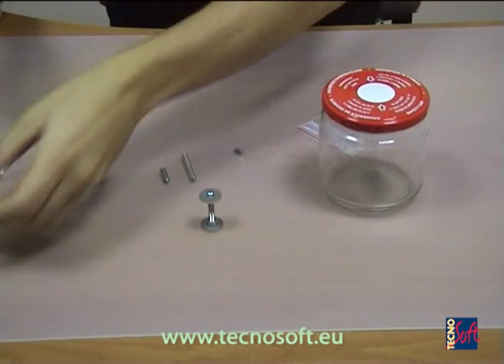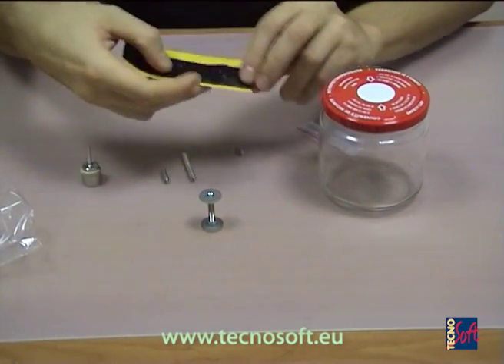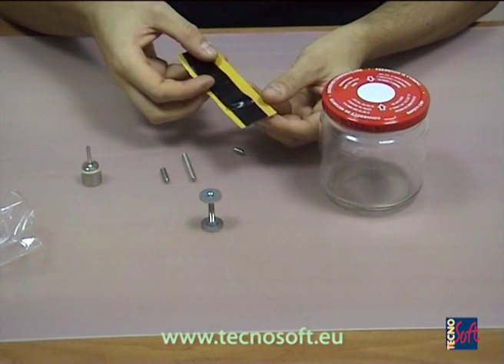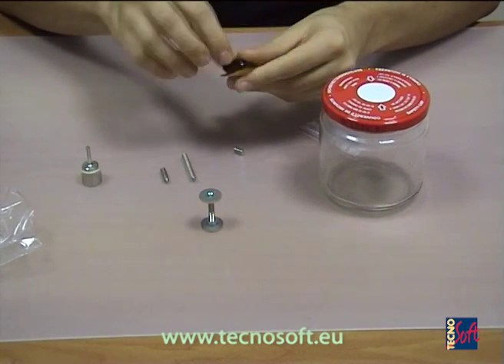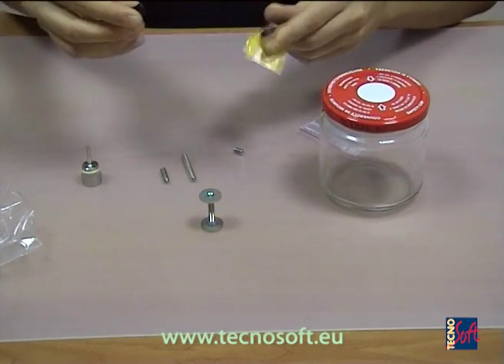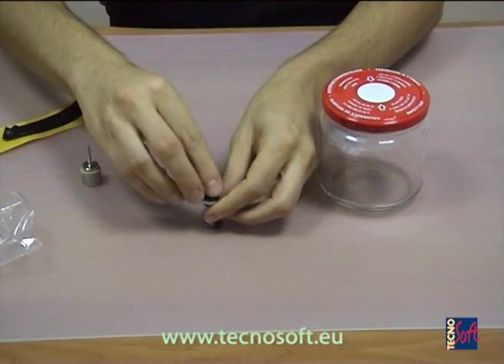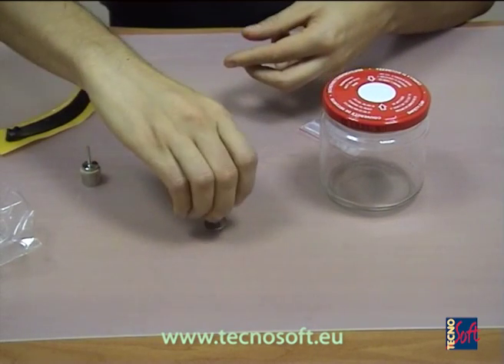There is one meter of adhesive rubber resistant to high temperature. Just take one piece of rubber — you can eventually reuse it several times — and put it on one base. Of course you have to put some other rubber on the other base where you are going to stick the logger.